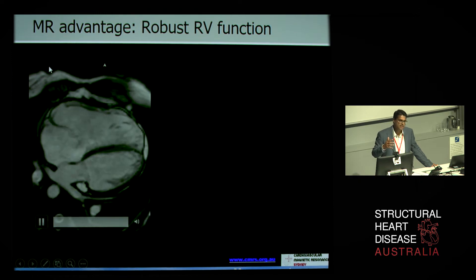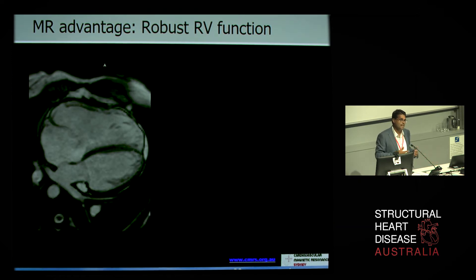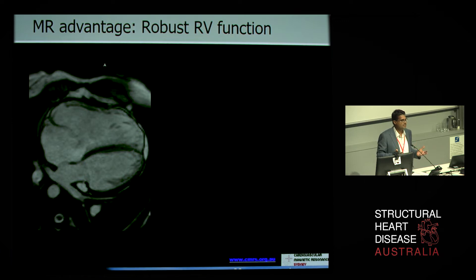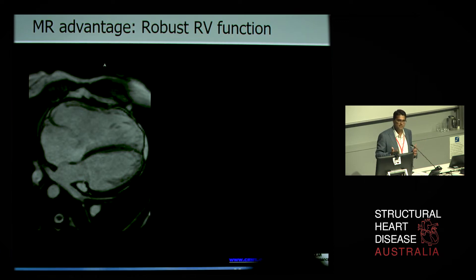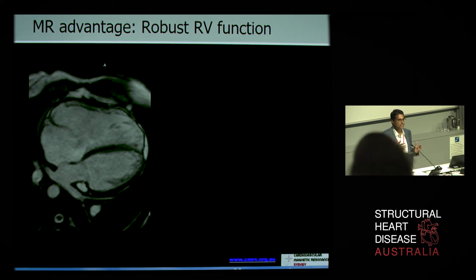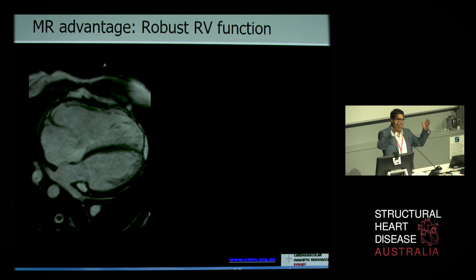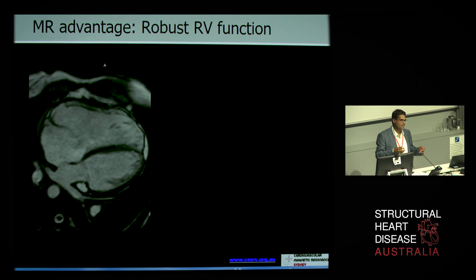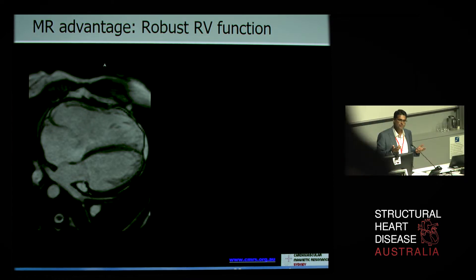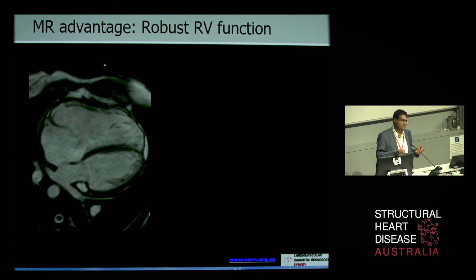We've already seen that CINE imaging has very large fields of view, which is very important. We have unrestricted imaging planes, so if we're looking at particular aspects of the right ventricle, we're not limited by operator dependency or angle, which an ultrasound beam might be. We're seeing the entire body, shifting around in different phases, interactively planning. We have very high spatial resolution, which is really important for the right ventricle, and we're able to appreciate the physiology and the anatomy in one go.